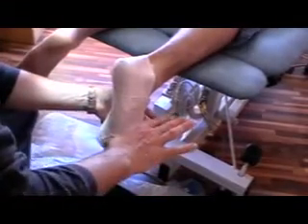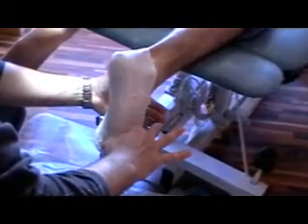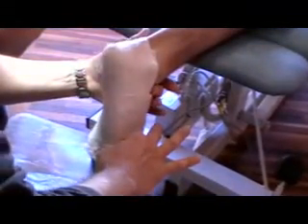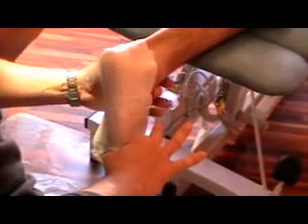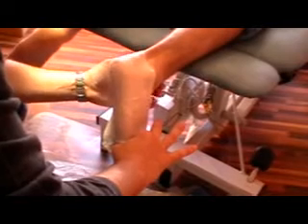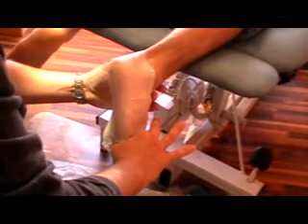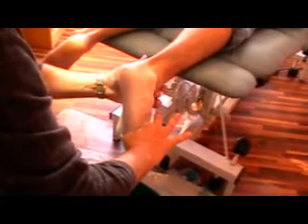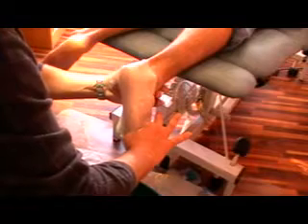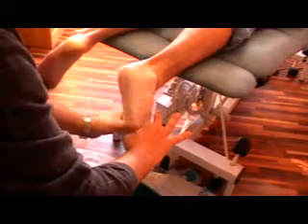Apply pressure on the fourth and fifth metatarsal head with your thumb. Pinch the top of the fourth and fifth metatarsal head with the other finger, and dorsiflex your foot to a 90 degree position. There are some circumstances whereby 90 degrees is not achievable, and the exception is when you have an equinus condition. You can manipulate the foot into its neutral position, and with your free hand ensure that the tendons are relaxed, and you can also smooth the cast even further.